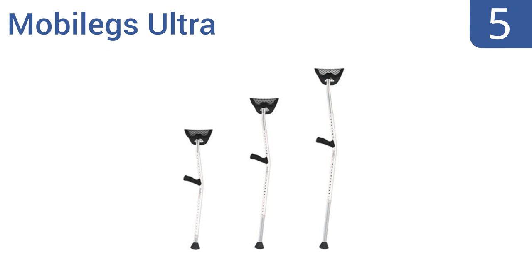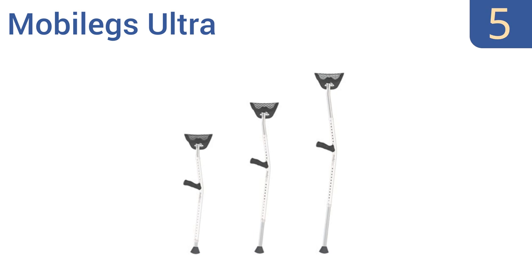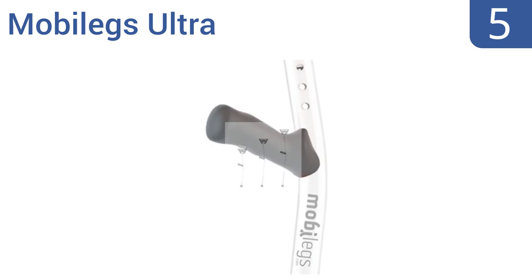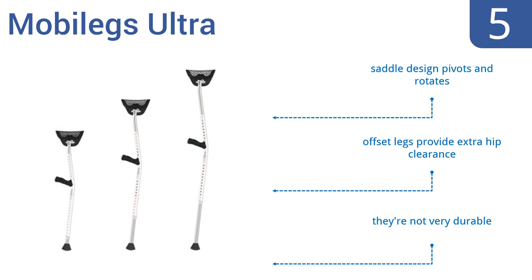Halfway up our list at number 5. Designed with ease of mobility in mind, the Mobile Ex-Ultra provides ergonomically designed hand grips that contour to the shape of your hands in order to maintain natural wrist angles and proper weight distribution across your palms. Their saddle design pivots and rotates, and the offset legs provide extra hip clearance. However, they're not very durable.